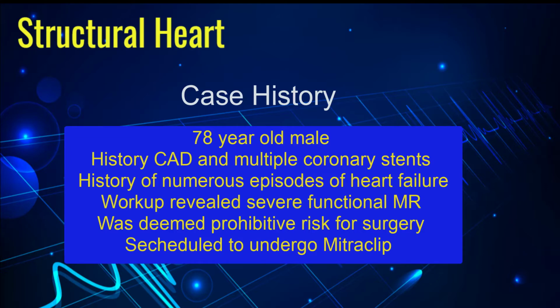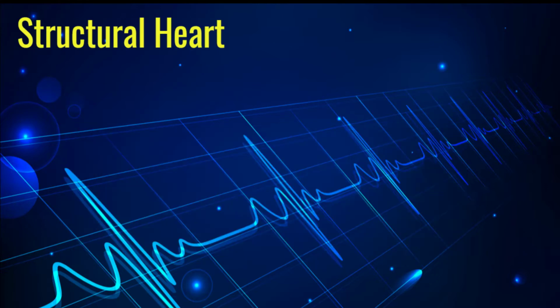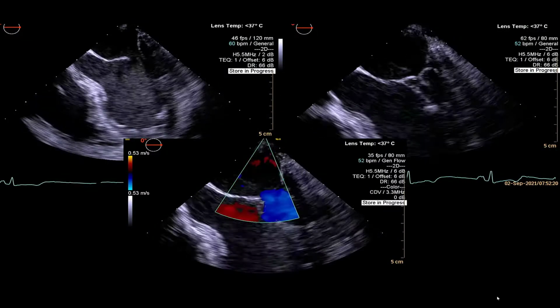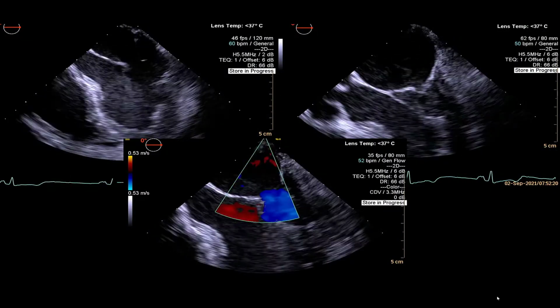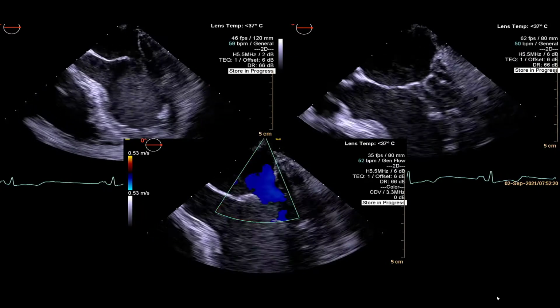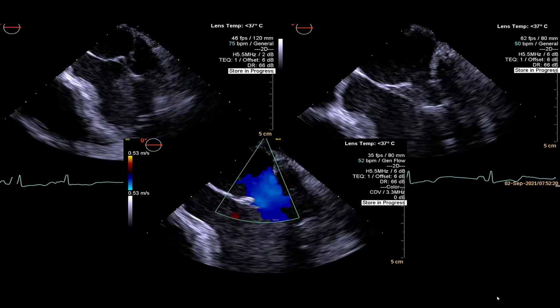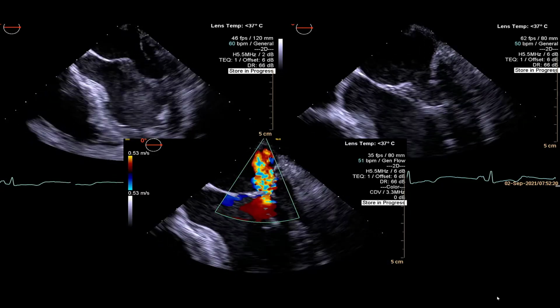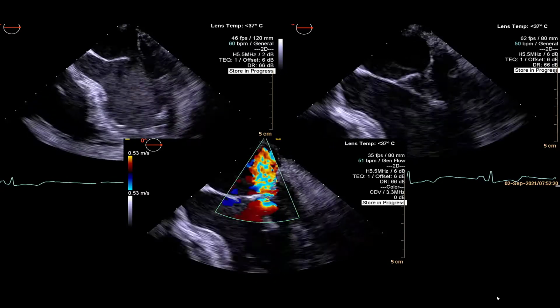We'll keep the history and physical examination short so we can focus on the problem at hand, that was the intraoperative or peri-procedural transesophageal echo examination. These are the first three initial images that we took in this patient. This shows a mid-esophageal four-chamber view, a little close-up of the valve, and a mitral regurgitation jet, which is going a little bit more posteriorly directed.